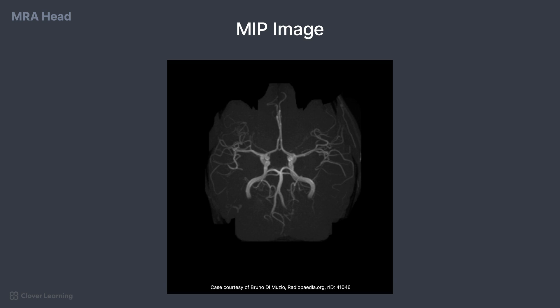MRA scans clearly demonstrate the arterial system in the head, also known as the Circle of Willis. Let's look at some important structures on MIP images of these studies. For the following images, the MIP has been turned in a way to demonstrate all of the vessels.